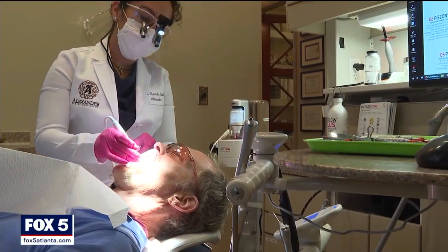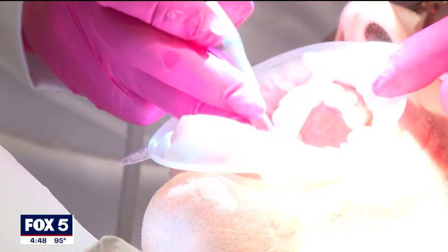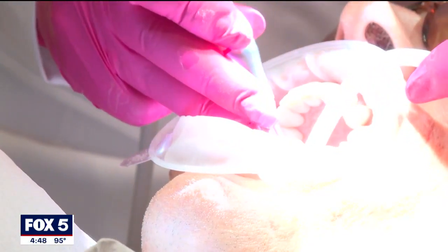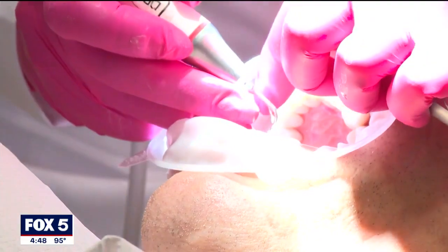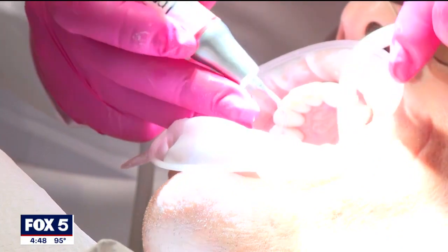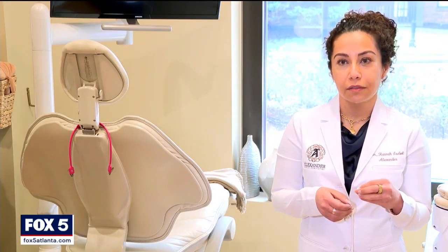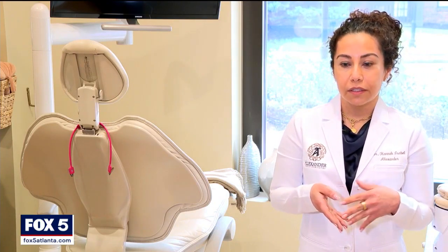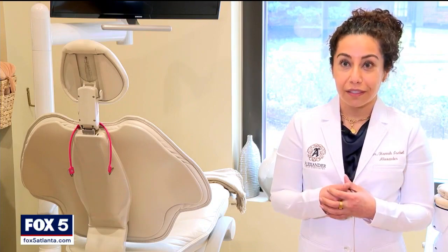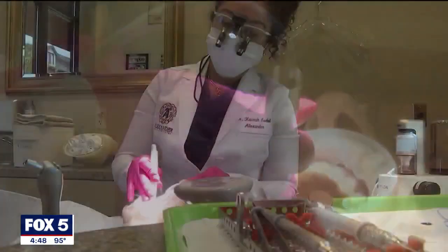So her practice has switched to airflow cleaning, a newer approach that uses a combination of warm water, compressed air, and fine powder particles to get rid of plaque and bacteria on and around the teeth. It's very gentle to the structure, the gums, and the tissue, and it allows her to get below the gum line — well below the gum line — at an angle of 45 degrees, so they can take out all the bacteria sitting in those pockets.